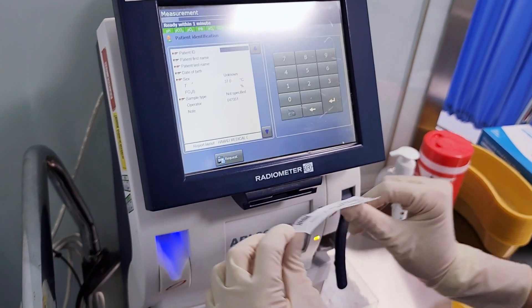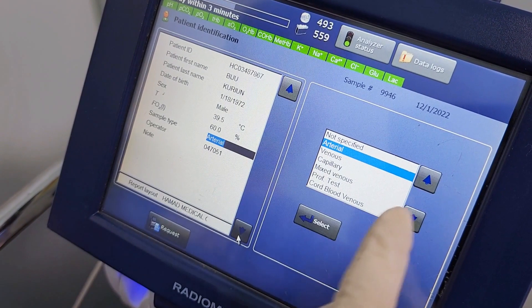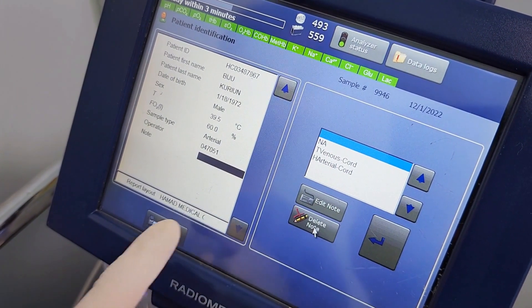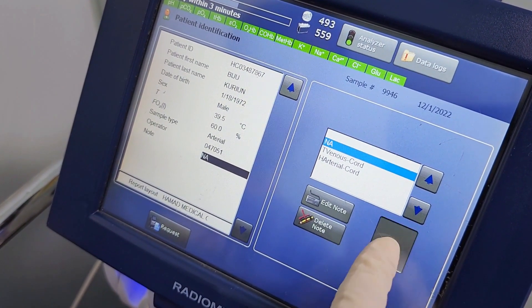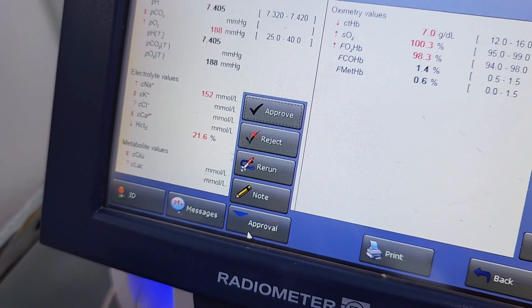Scan the patient barcode. Add mandatory information to specify the diagnostic. Results will appear in 35 seconds and will be printed automatically. Approve the result.